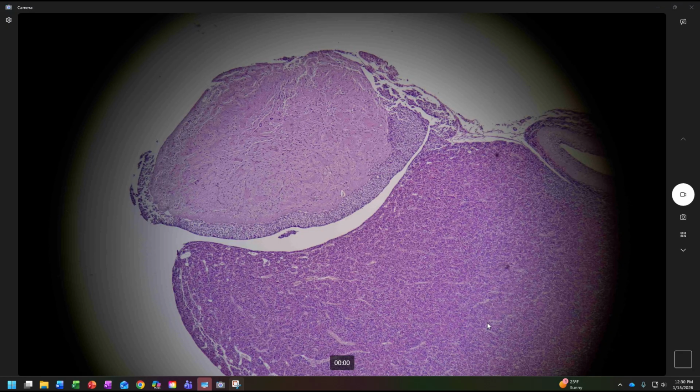So for the endocrine system lab, we're only really asking you to identify structures of three places: the pituitary gland, the pancreas, and the thyroid gland. And so this is the pituitary gland, also referred to as the hypophysis, not hypothesis, the educated guess step of the scientific method, but a hypophysis, P-H-Y-S-I-S.